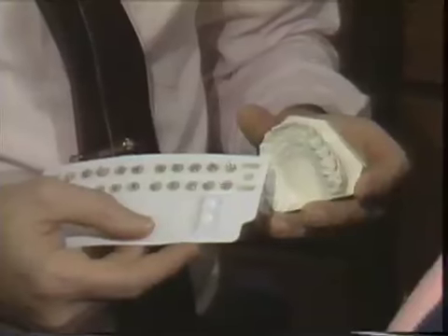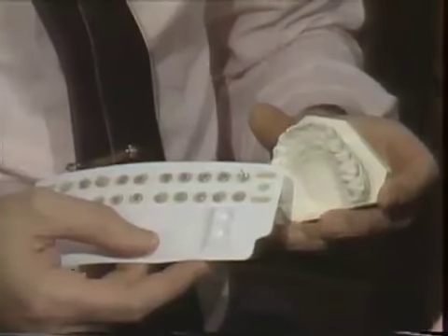Of course, the principle of a one-step or a no-mix adhesive is that the catalyst for the paste is in the liquid primer. That liquid primer is applied to the back of the bracket, the base of the bracket, and of course to the tooth surface itself, and then the paste is applied to the bracket. When the bracket is applied to the tooth, the primer sandwiches the paste between the two layers, and that's what starts your polymerization. Therefore, if your bracket base is not perfectly flush all the way across the base on the tooth surface, your bond strength will be considerably weakened. And this is most prevalent in bicuspids and also in molars.